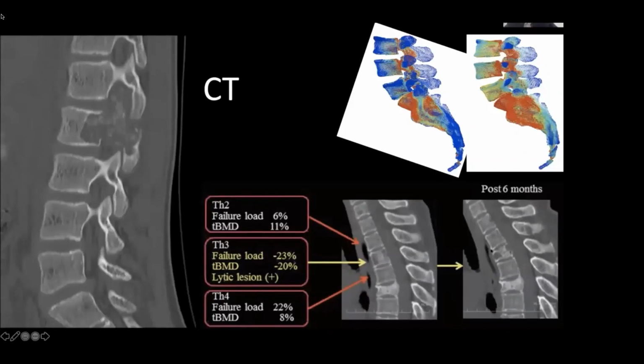There are various software algorithms that are becoming more and more available in terms of assisting your ability to decide various characteristics of pathology. So for example, to make an assessment of whether a vertebra with a vertebral lesion, including a metastasis, is a stable or an unstable lesion. How would you guys typically make that assessment now? Do you have any sense of how that's done? Determining instability in the context of a spine metastasis or a spine neoplasm?